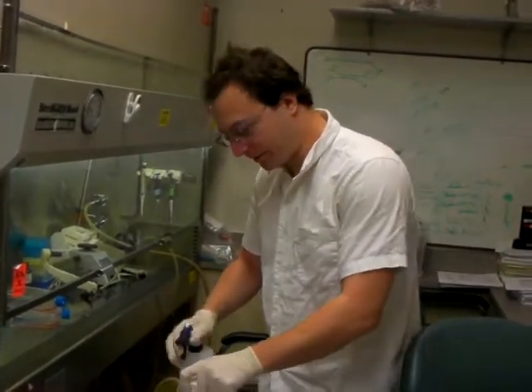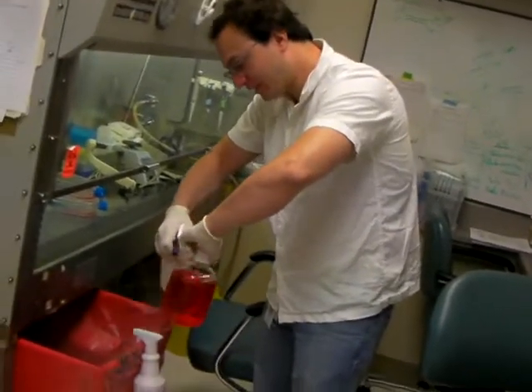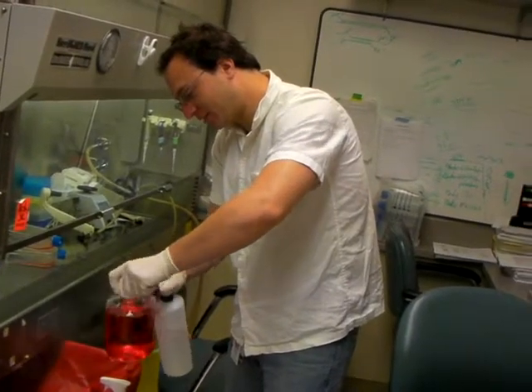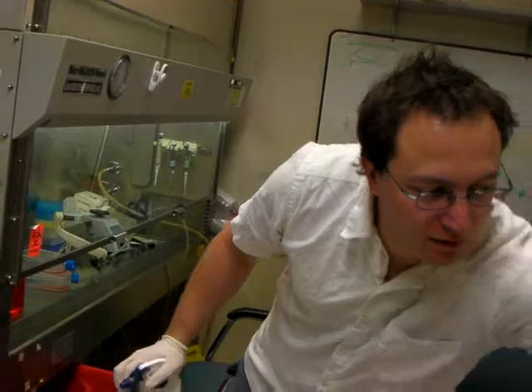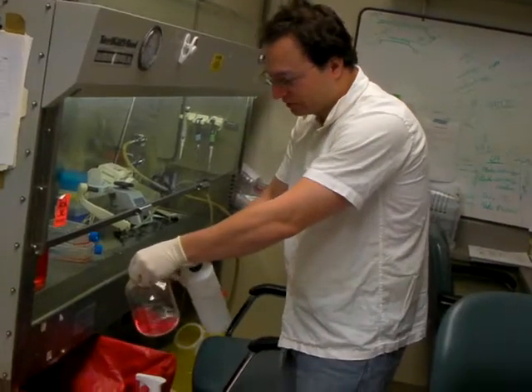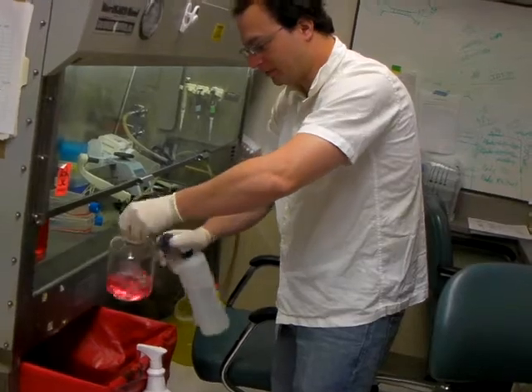That little bottle is what I used to get the cells off of the plate — it's called trypsin. This is my concoction of cell media; you can find this information online anywhere. The neck is probably the most important part — that's where you open and close, so it should be the most sterile part. The rest you can just quickly spray.